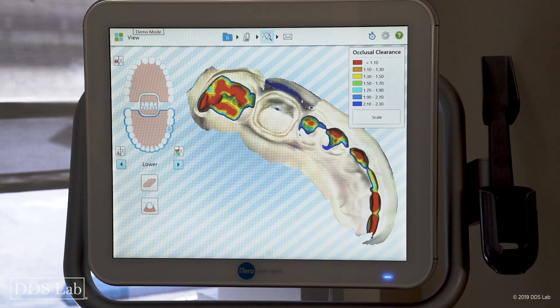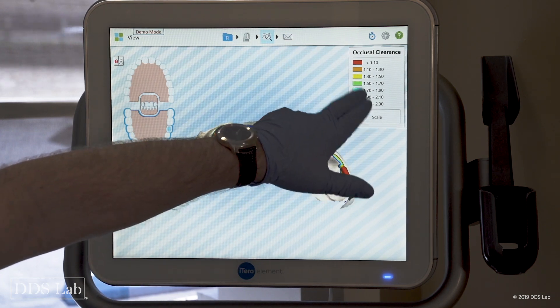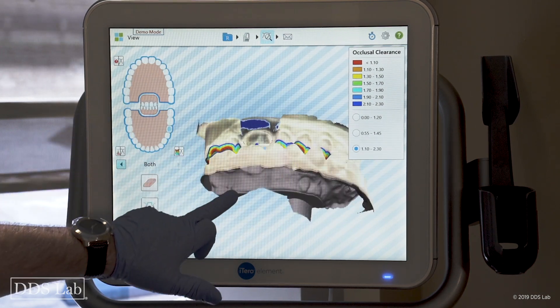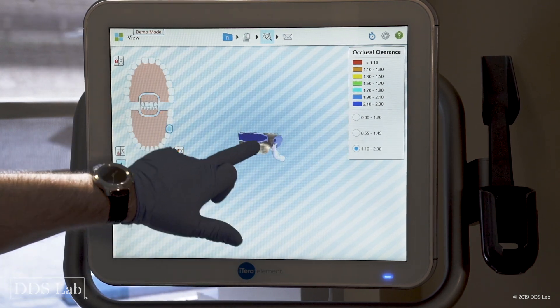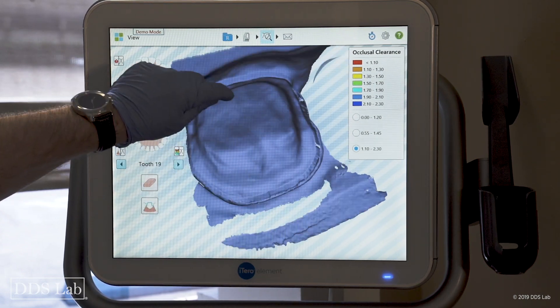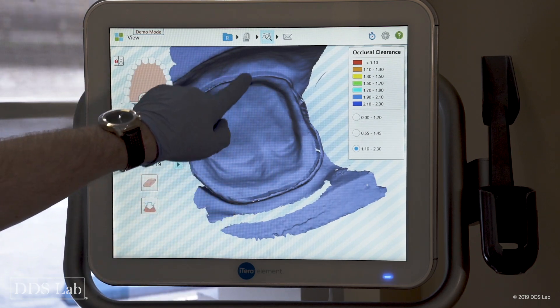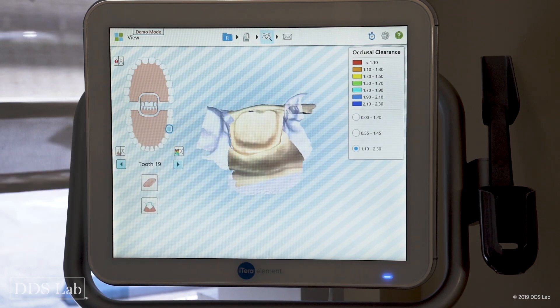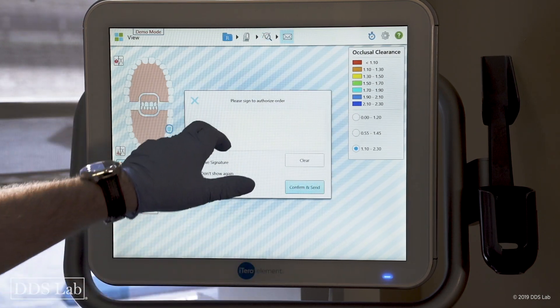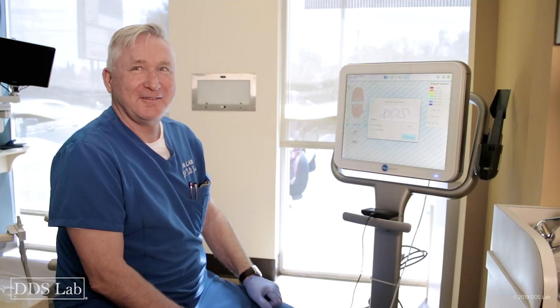I'm going to look at my results in the viewer — I check my clearance, looks all good. Then I look at my margin again, and turning the model around I can see exactly where my margin is — it's absolutely clear. I'm done, and now I can send it to the lab. In this case it's going to be DDS.